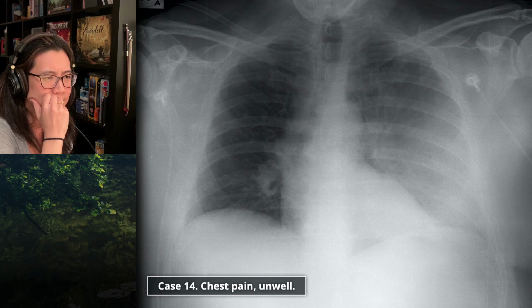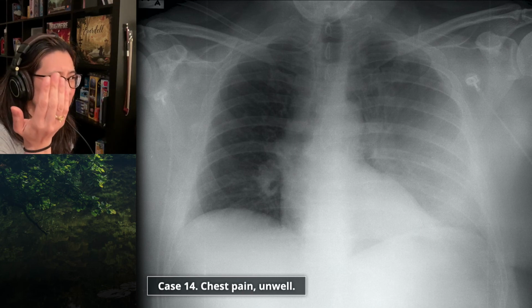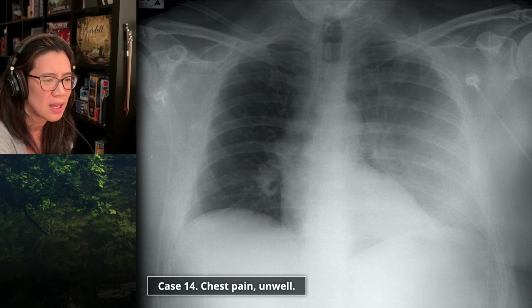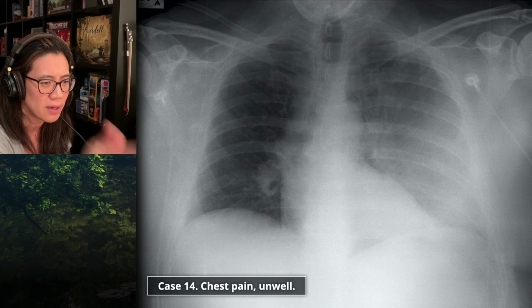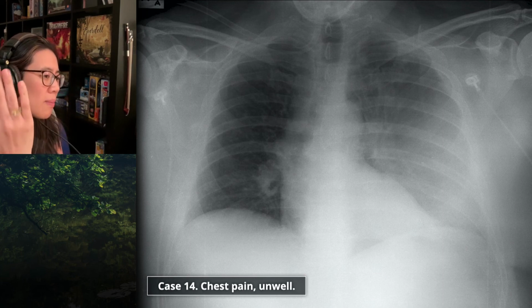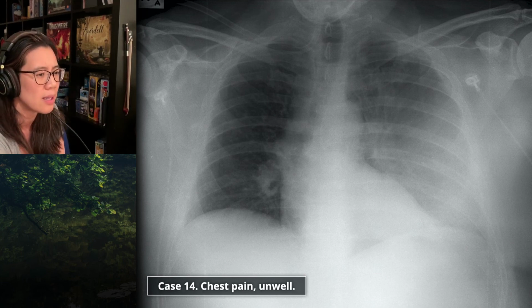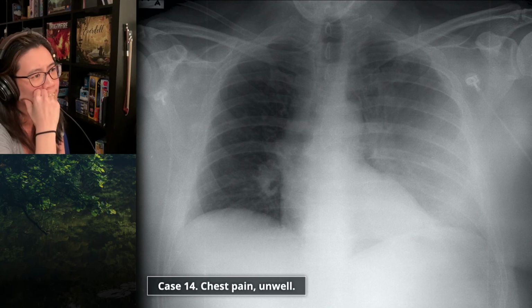What's against an effusion? Well, the patient is upright, and I don't see blunting of the costophrenic angle, but that might be because it's loculated. And you can see the entire left hemidiaphragm. Yes, but if it was loculated posteriorly, you might see the entire hemidiaphragm, wouldn't you? Right. Is there any evidence of pleural fluid anywhere?